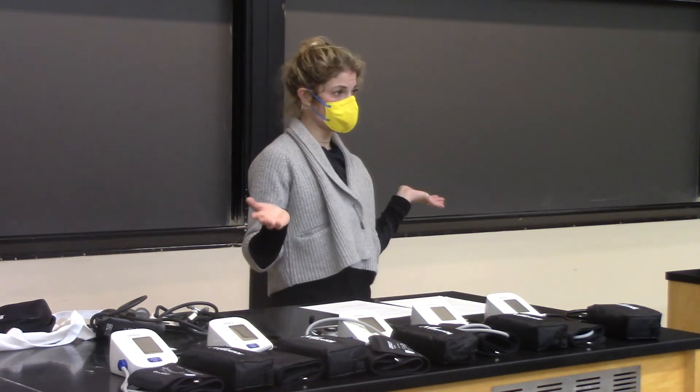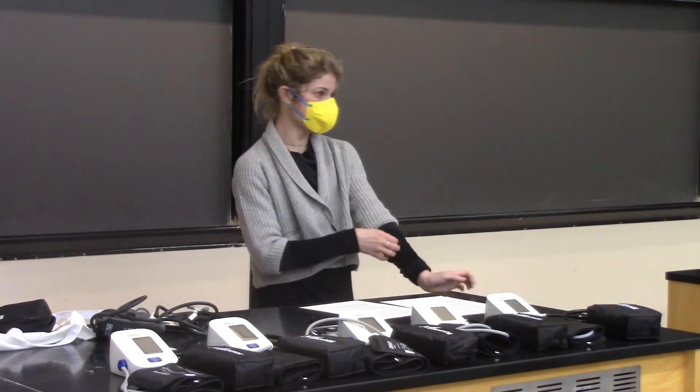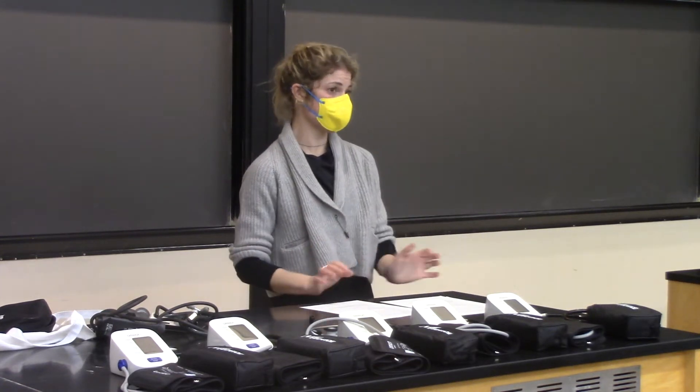You'll never forget how to take your blood pressure. You do not need to be a doctor to know how to take blood pressure. I taught this to my husband last night, and he's a lawyer.